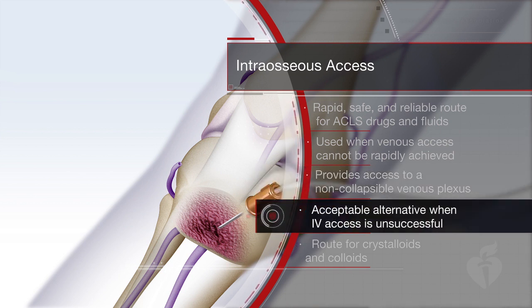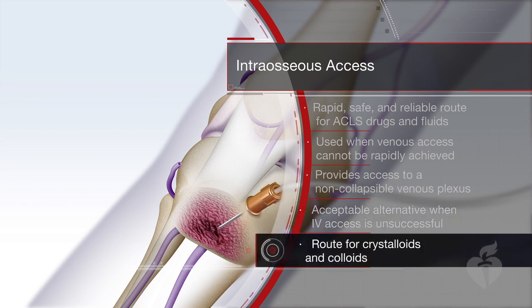Although providers should attempt to establish IV access as the first attempt for drug administration during cardiac arrest, IO access is an acceptable alternative when IV access is unsuccessful. IO access also provides an alternative route for the administration of crystalloids and colloids.